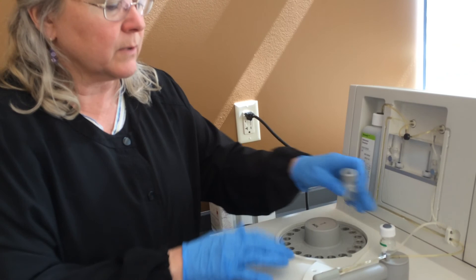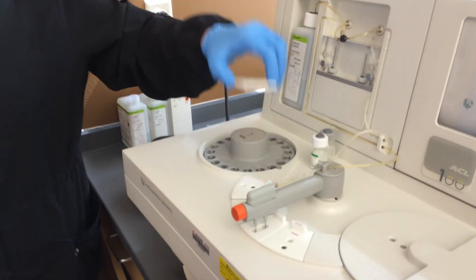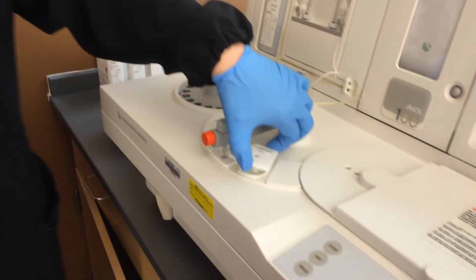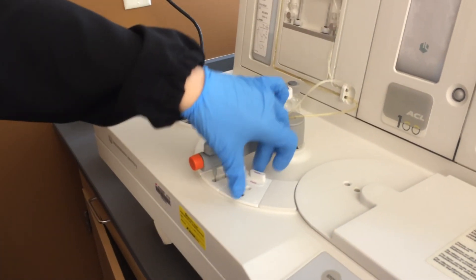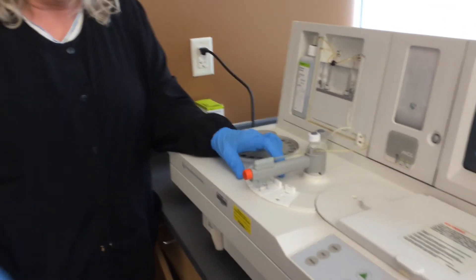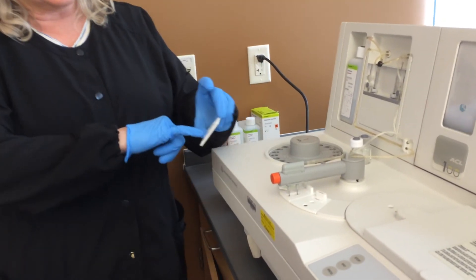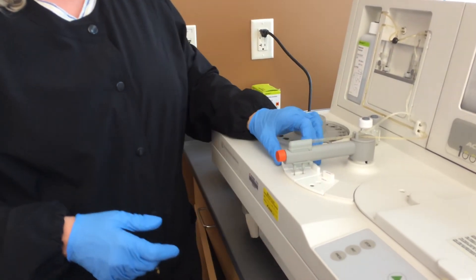We have loaded here our protime reagent with a stir bar, our PTT reagent with a stir bar, and the calcium chloride reagent — it doesn't need a stir bar. If you look closely, you'll see that there are two probes here, and they have to go in either one of those holes.